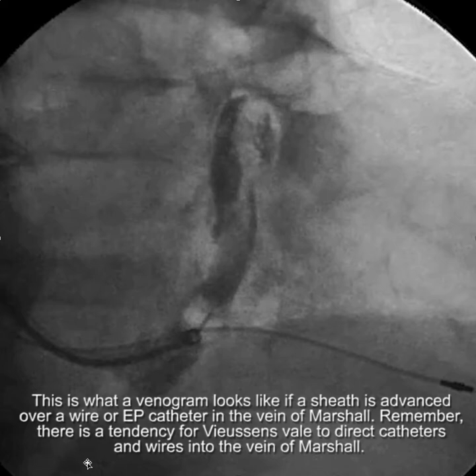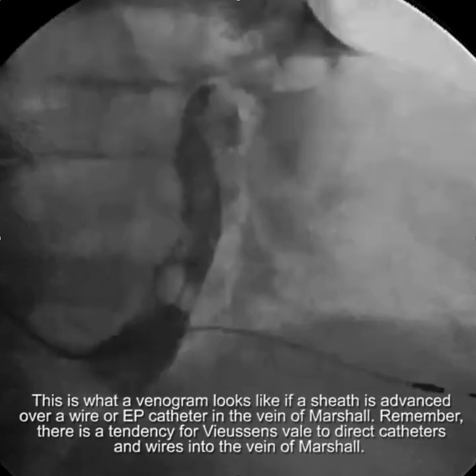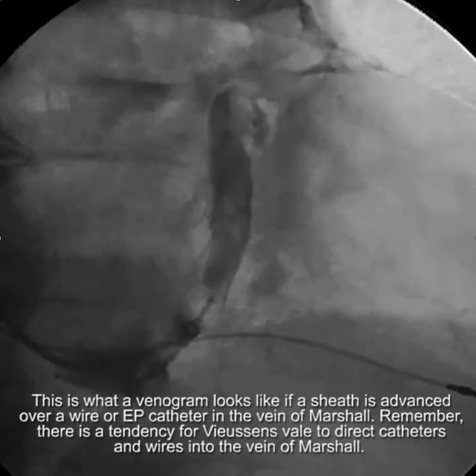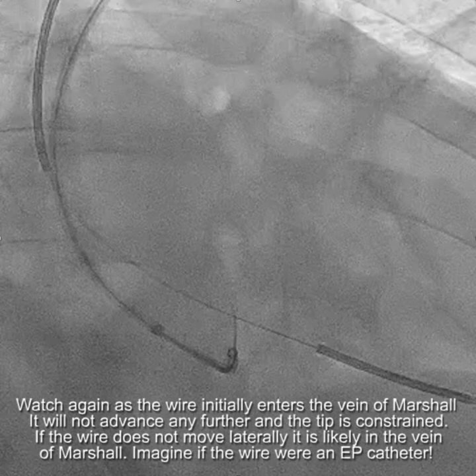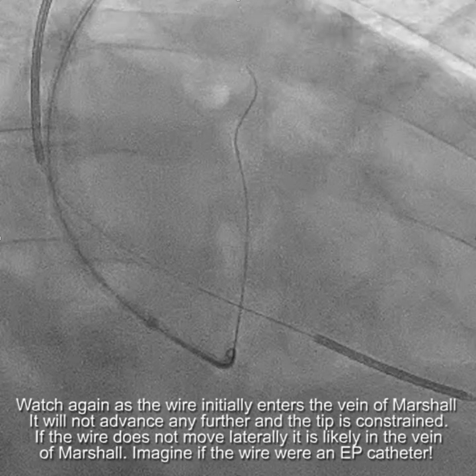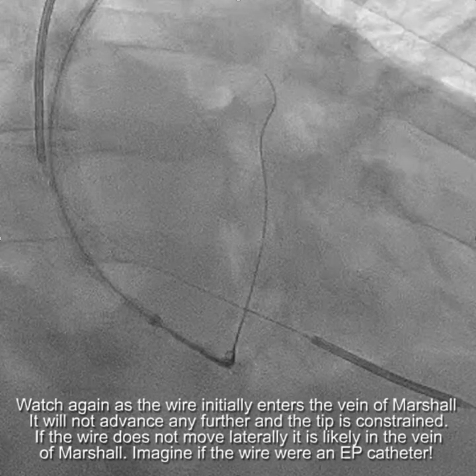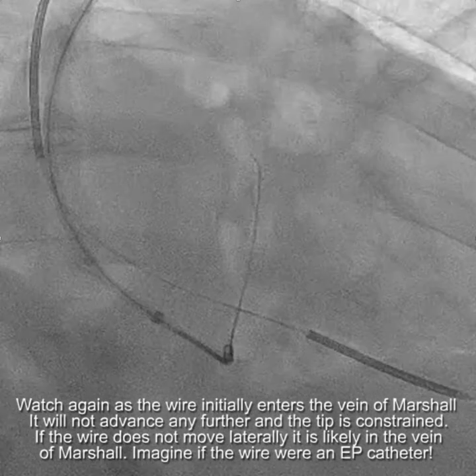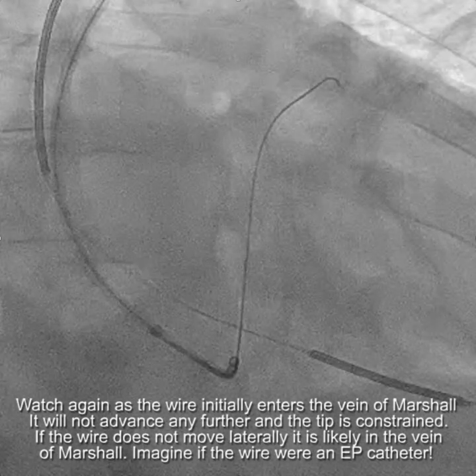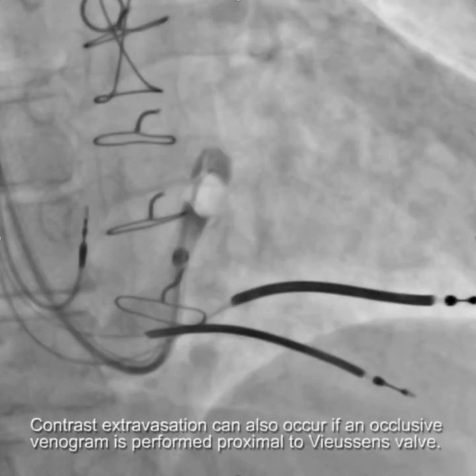There's a tendency for Vusensian's valve to direct catheters and wires into the vein of Marshall. Watch again as the wire is advanced and initially enters the vein of Marshall — and for all the world it looks as if it's in the true CS. But when it's withdrawn and re-advanced, you can see that it actually enters the great cardiac vein above the vein of Marshall.